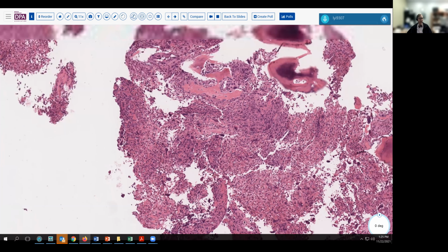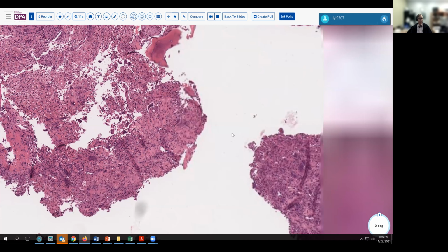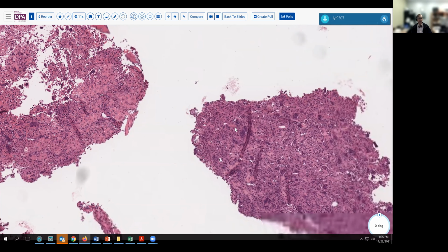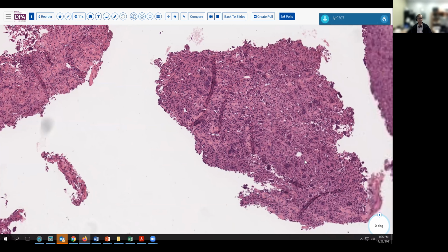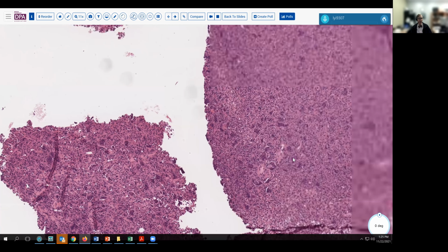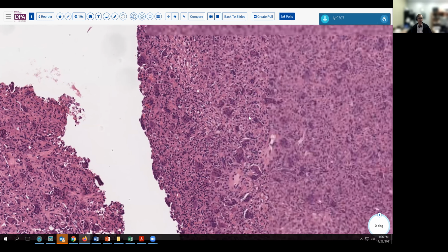So in this situation, if you just have the histology, it might be a little bit difficult because you do need the radiograph to be able to discern that that ossification is at the periphery and that it's in a reactive type of form. And it's not coming out of the entire bone lesion. We do have all of these giant cells, and as we discussed in the other case presentation, these nuclei are all quite bland, and the stromal cell nuclei are similar to those of the tumor.